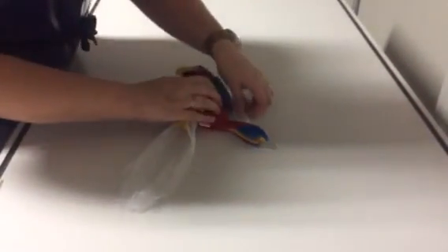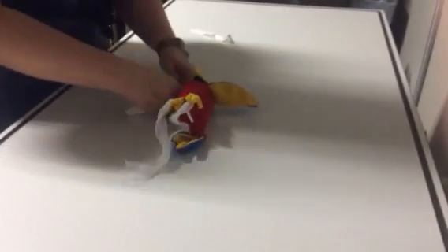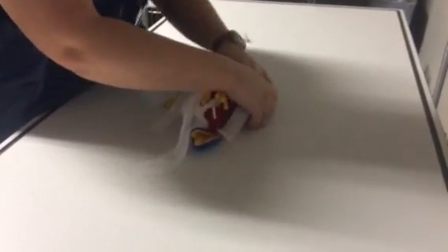I can pull back these, tape these, and then I can just move the tail out the way — so that would be a lateral. And then if I want to do a VD, you can tape the wings this way. You can also tape the tail too. You need to spread that out, and you can pull these out of the way and stretch those out as well. So that would be the VD.